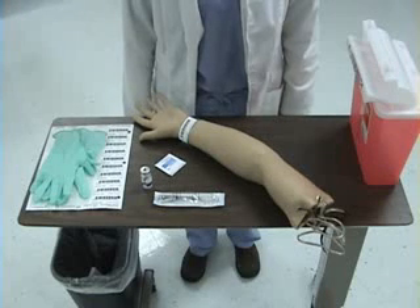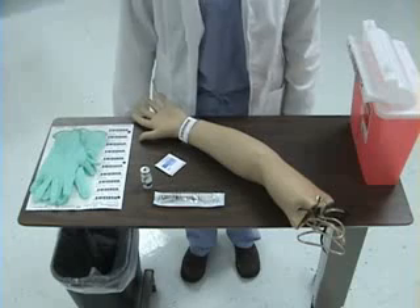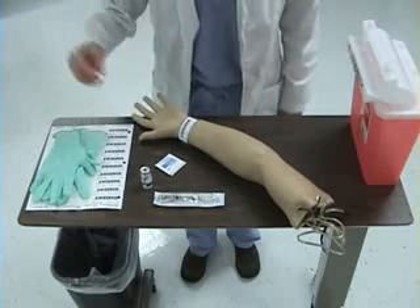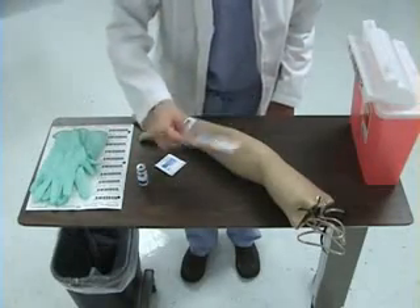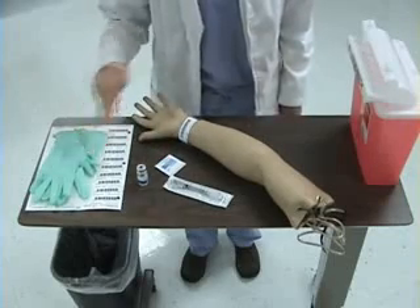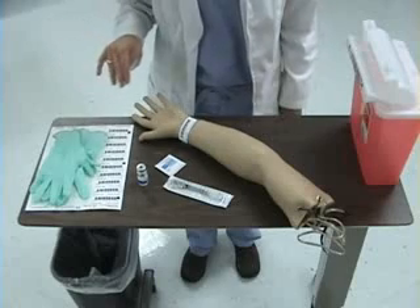This is a demonstration of administration of an intradermal injection. To begin, I will gather my supplies and check my PCP order. I need a vial of PPD solution, a tuberculin syringe, alcohol preps, patient labels, gloves, a sharps container, and a trash can.